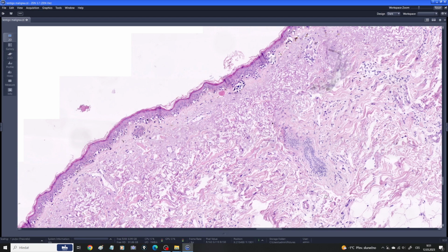And as I said, it starts with lentigo simplex, and you can see it here. So this is lentigo simplex. Lentigo maligna. So this is lentigo maligna. And if you hear the term lentigo maligna, it tells you that there will probably be some resemblance to lentigo simplex. Both lesions are characterized by linear proliferation of melanocytes, which you can see here.